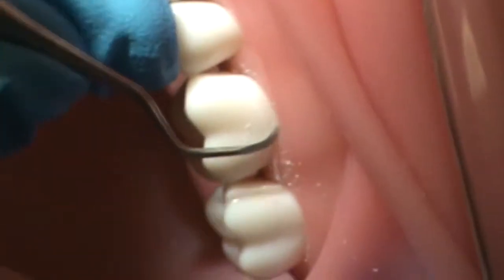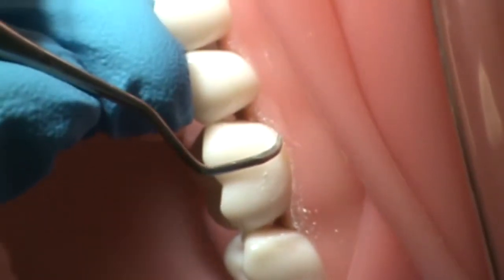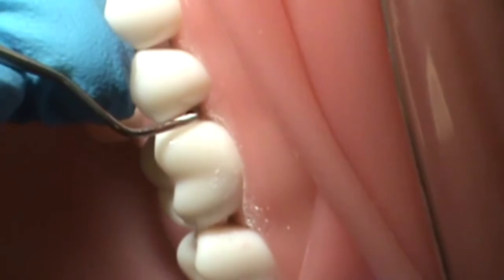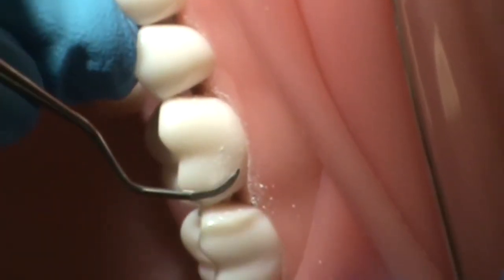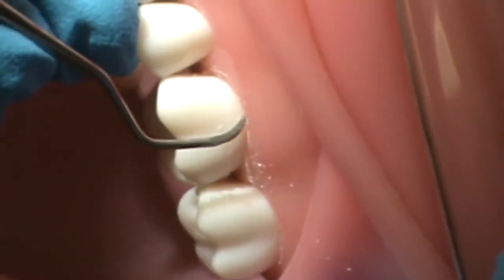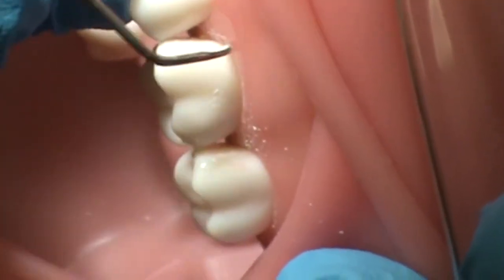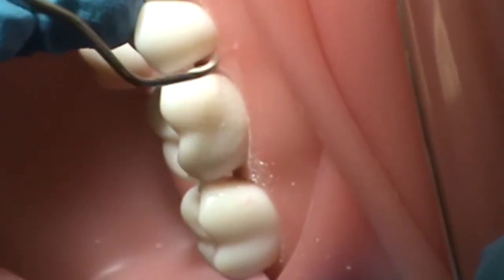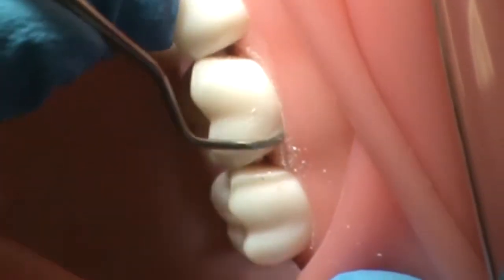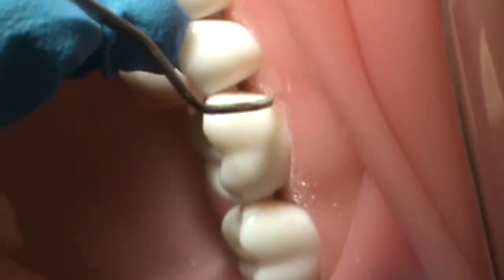She will establish an 80 degree face-to-tooth surface angulation by tilting the lower shank towards the root, meaning away from the tissue, so as to avoid trauma or unintentional gingival curettage. Her initial stroke will be in a coronal direction and she will utilize short controlled overlapping strokes that can either be vertical, horizontal, or oblique, applying appropriate lateral pressure and keeping the cutting edge in contact with the tooth at all times.